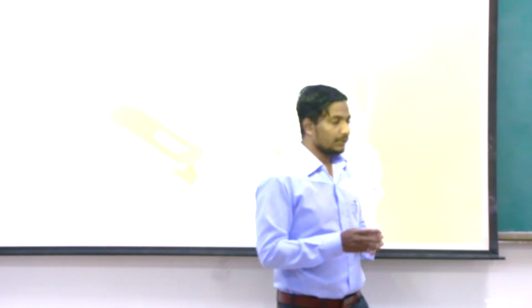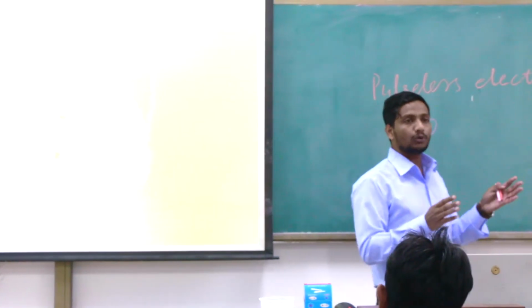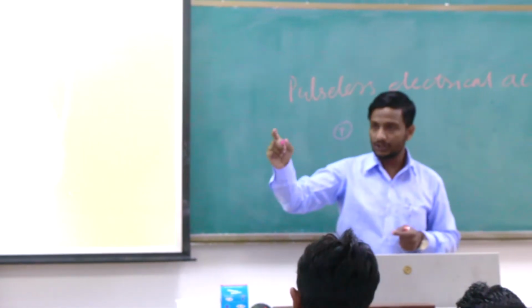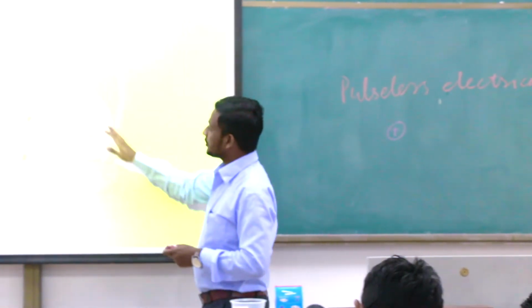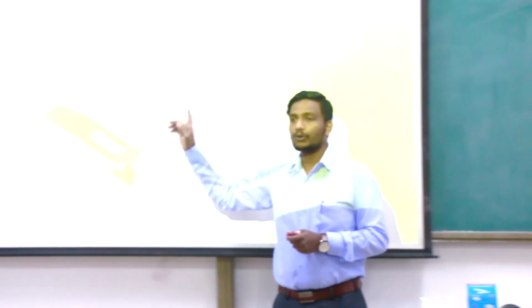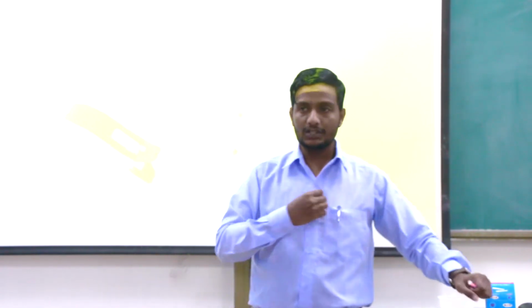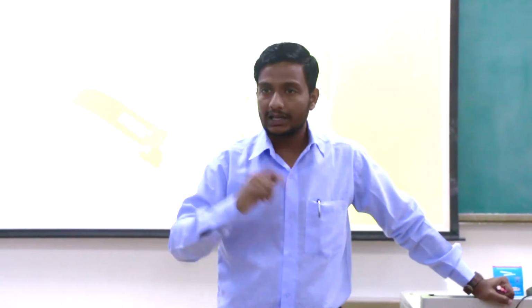So remember, if they are working alone, they are always positive. And when they are working in a group, we have to find out which one is negative and which one is positive. The good thing is, all the chest electrodes work alone. It means all of them are going to be positive or negative? Positive. And the center of our heart, the center of our body, is going to behave as negative.